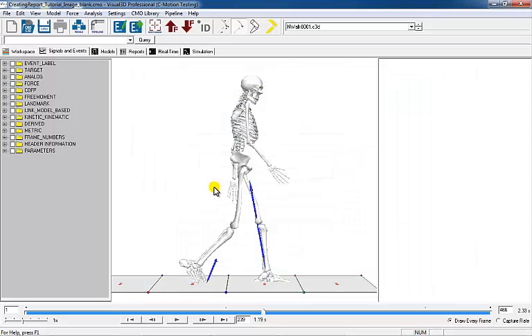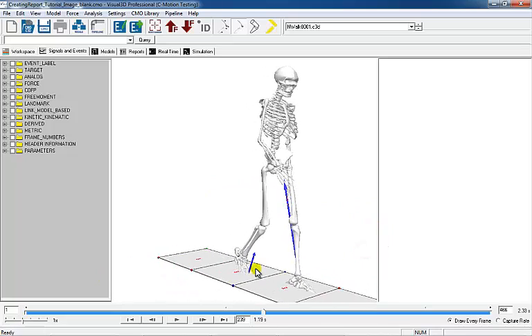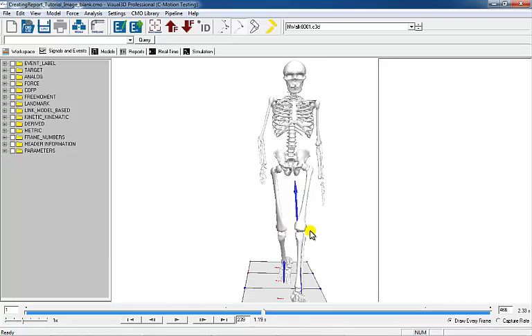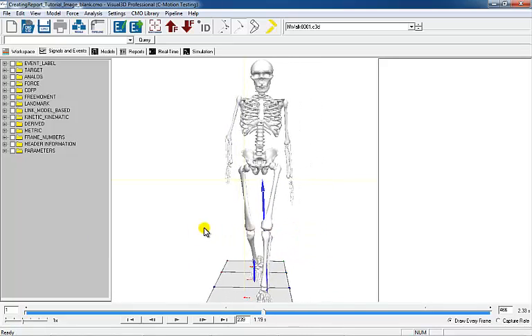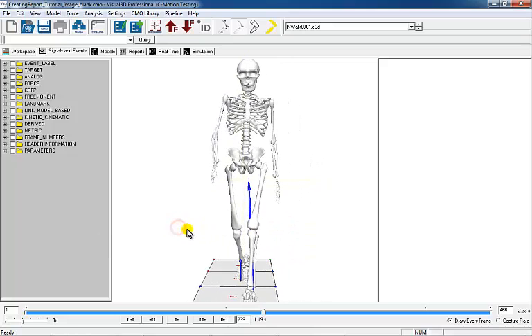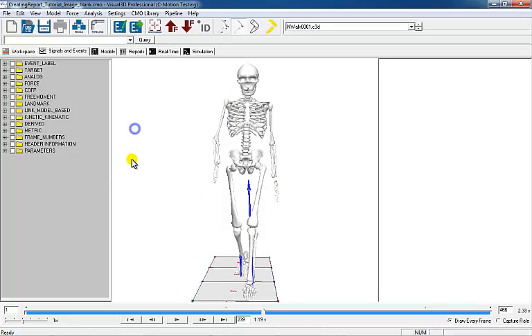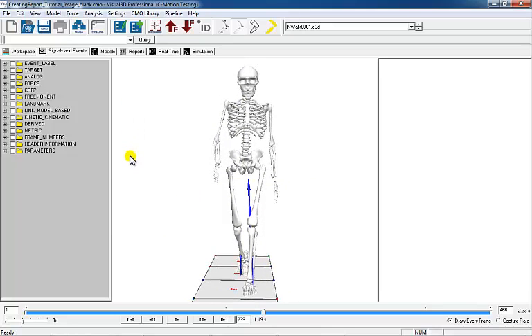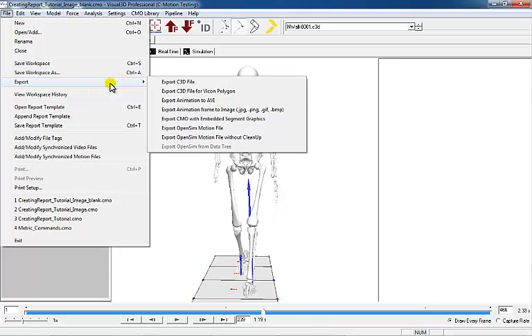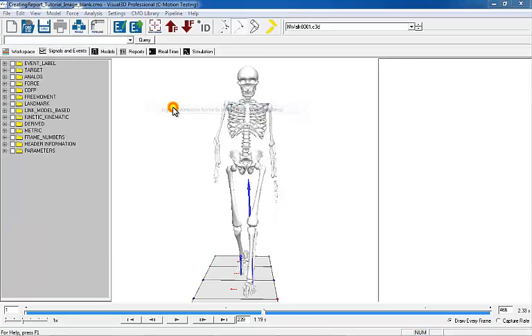Now rotate the 3D view of the skeleton to an AP view. Go to File, Export Animation Frame to Image and enter the Export File Name.